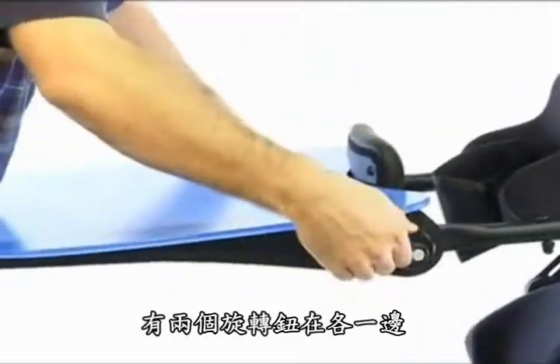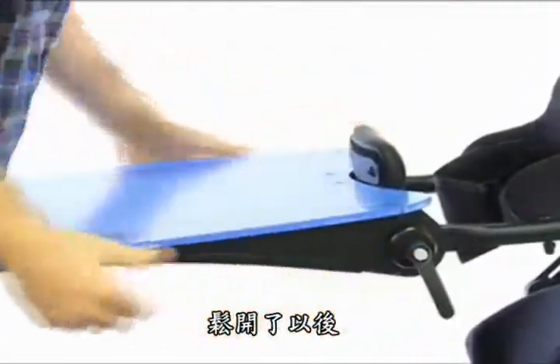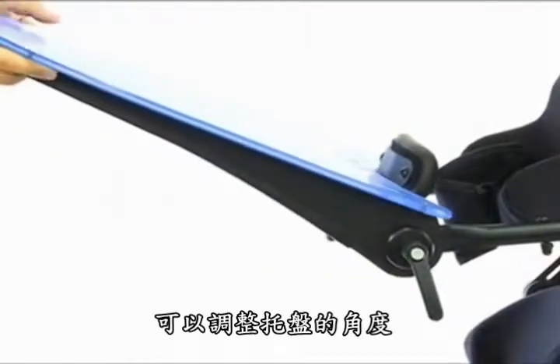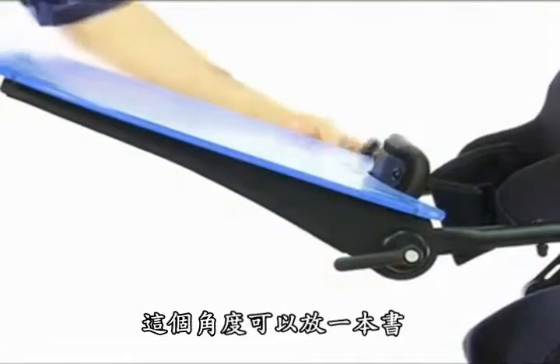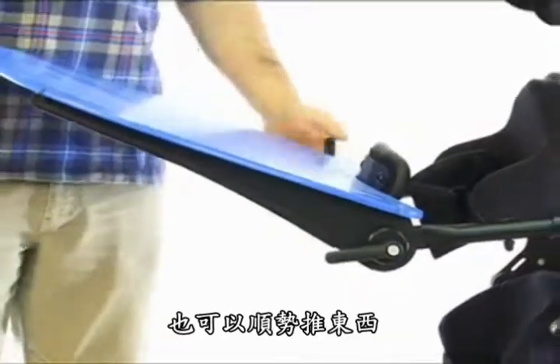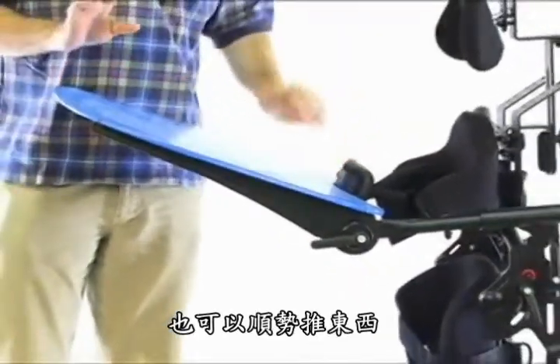The two knobs on the side, if we loosen those, allow us to set the tray with some adjustment in the angle. This is nice for setting a book on or for the child to push off of.